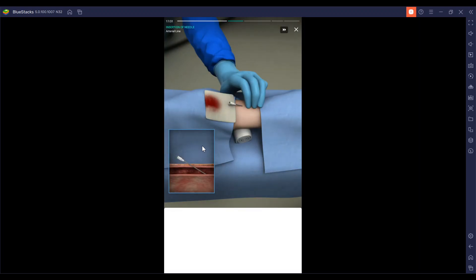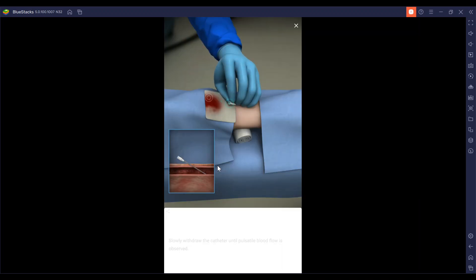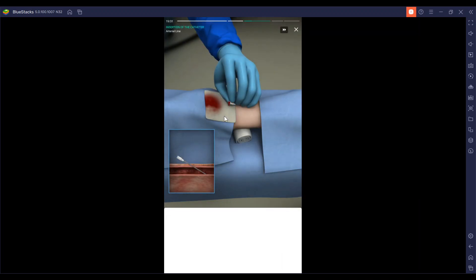We are going to remove that needle. We're going to stabilize the catheter with our non-dominant hand and slowly withdraw the catheter until pulsatile blood flow is seen.